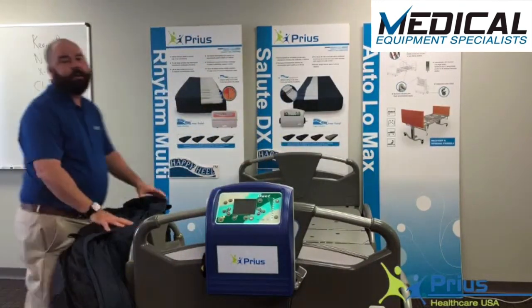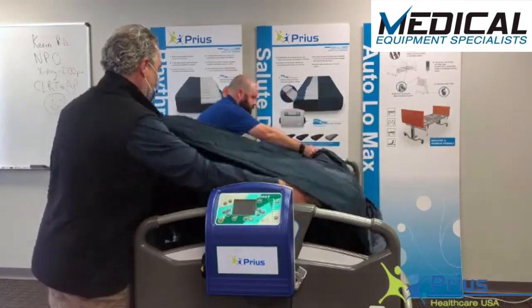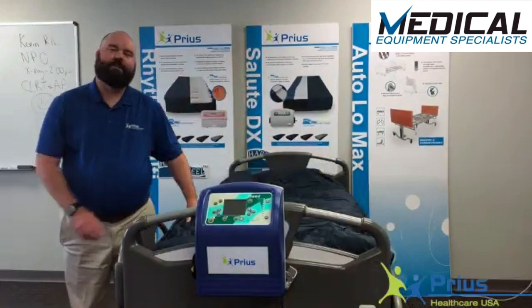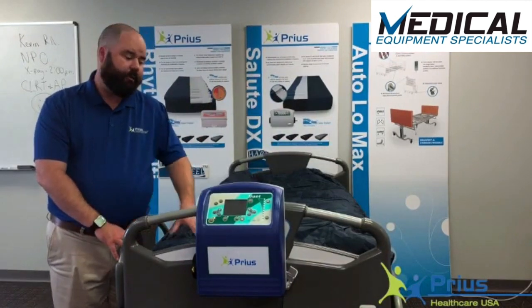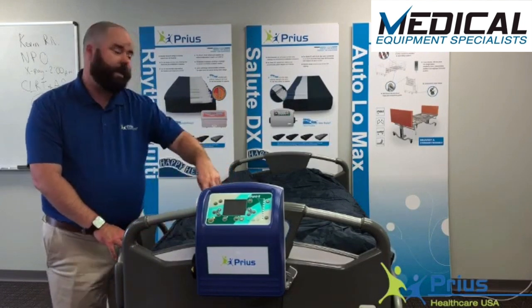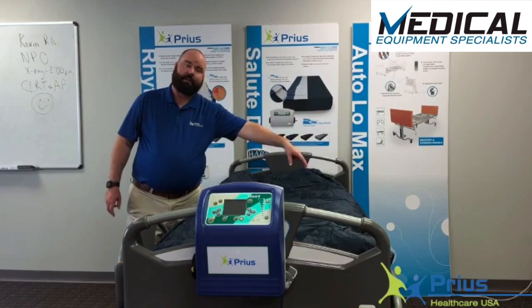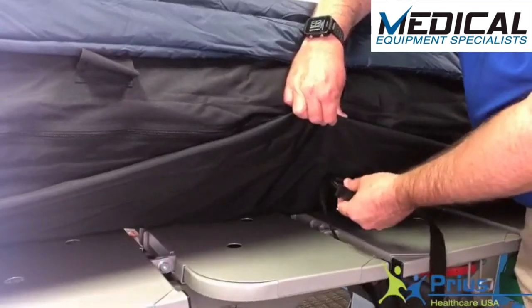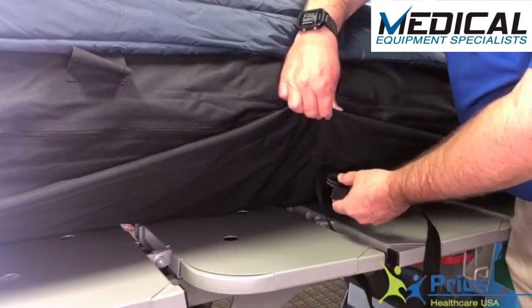The second part is the mattress. Once the mattress is placed onto the bed frame, we then need to attach the 8 D-ring straps to the bed deck itself. There are two straps at the foot end, two straps on the patient right-hand side, two straps on the patient left-hand side, and two straps up at the head.